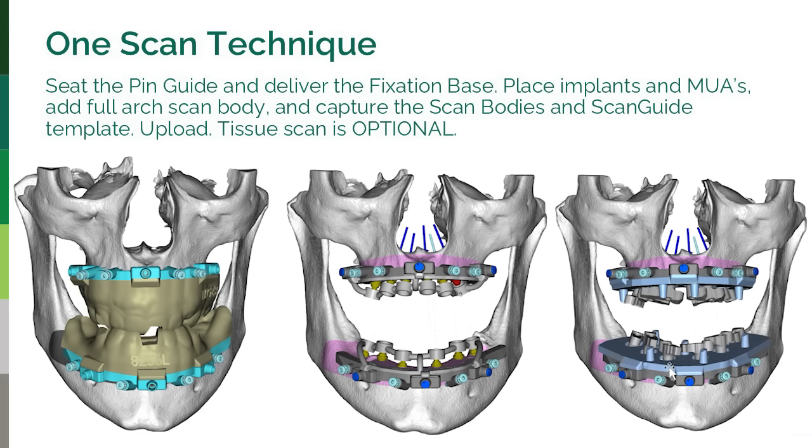If you read our article in Dentistry Today, we spent a lot of time talking about how this is a mask to cover all of the blood, the moving tissue, the sutures, and the irregular heights that happen in a surgery from extractions and bone grafting, that kind of thing. So it's not a predictable surface.